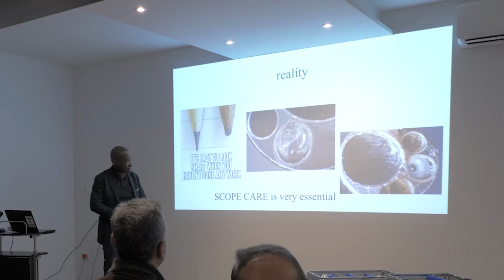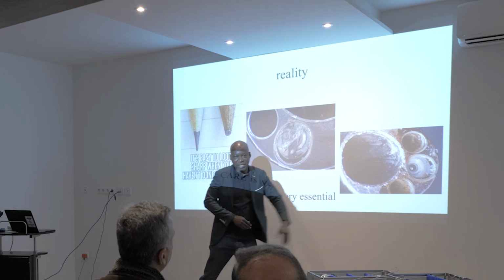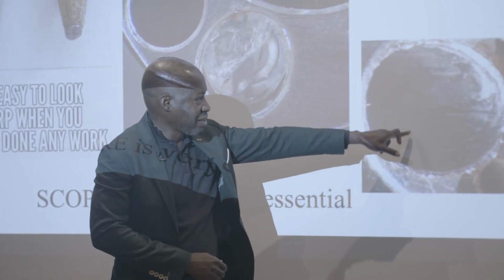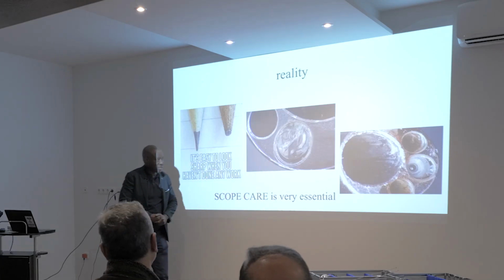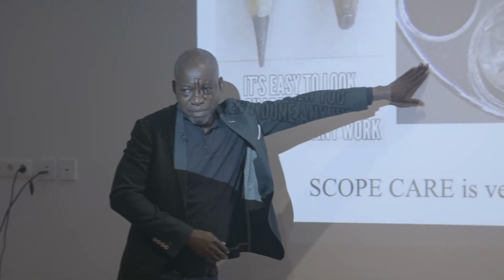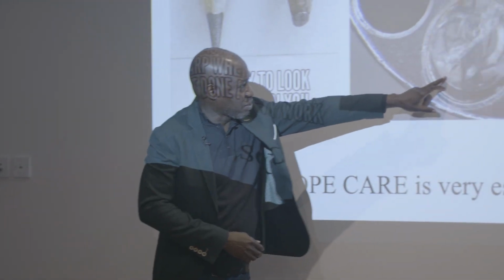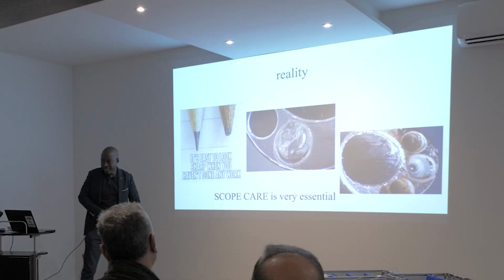And of course, these are my tools. After doing some series of surgeries, for example, this I did more than 200 cases before it got broken. So in 200 cases, it became like this. I sent it back to Maximo, and I got an exchange. And this I did about 50 cases. And it was accidental. I was teaching somebody, and then he hit the lens with a bone. And this is how it got broken.